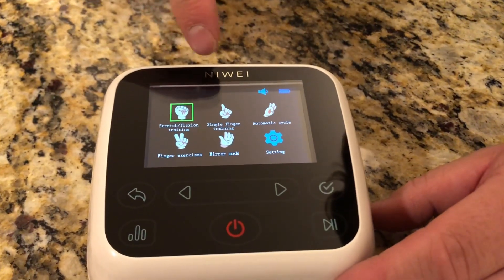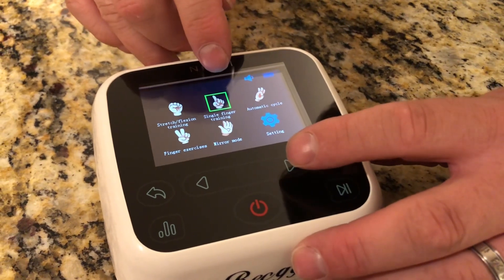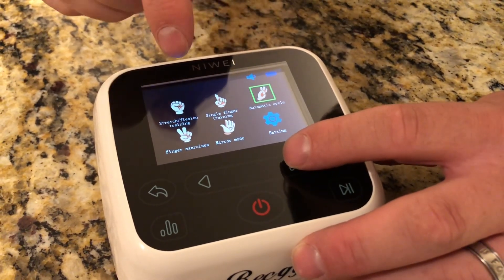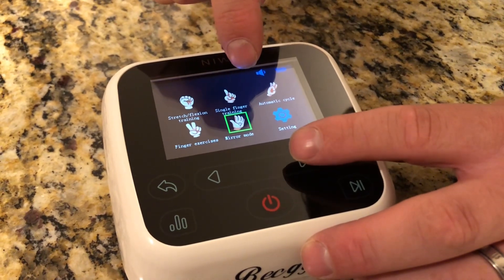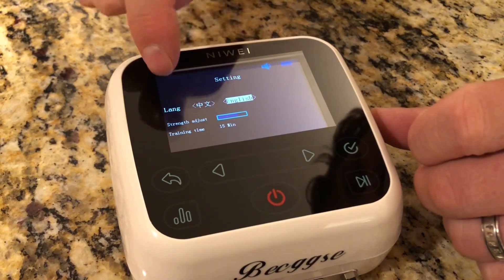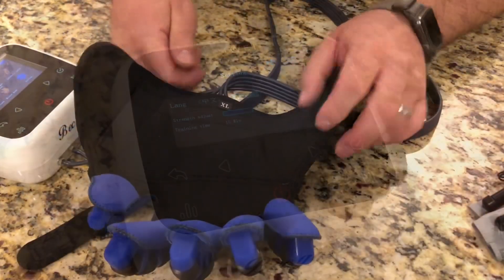This glove has five different modes: a stretch and flex mode, a single finger mode, an automatic cycling mode, a finger exercises mode, and a mirror mode which uses both gloves. It also has a few settings where you can set the language, the strength of the unit, and the training interval time.